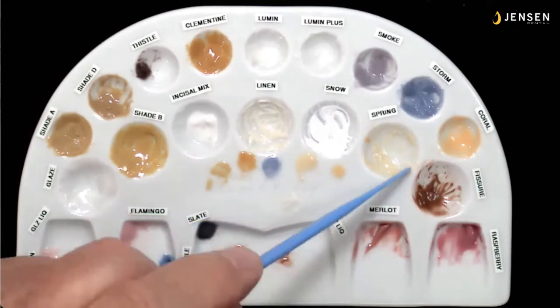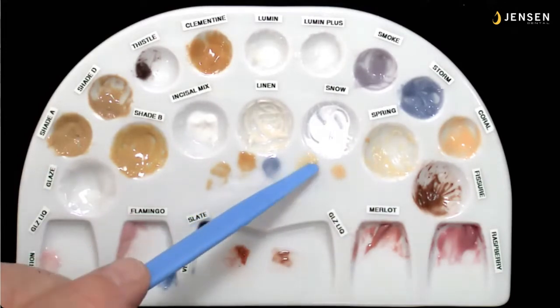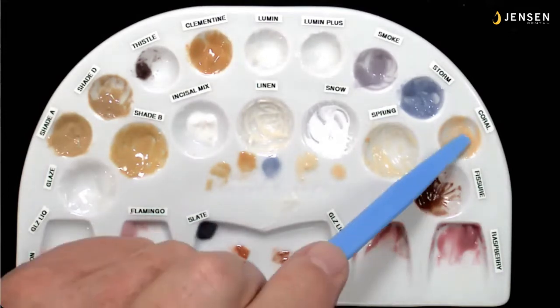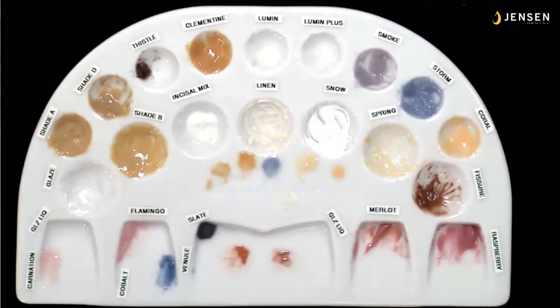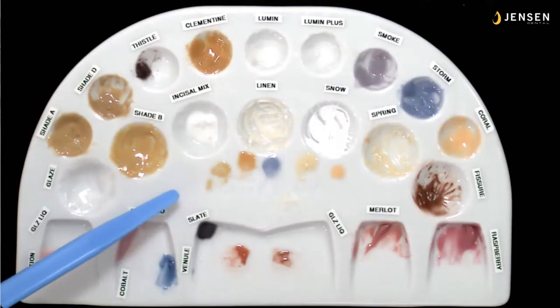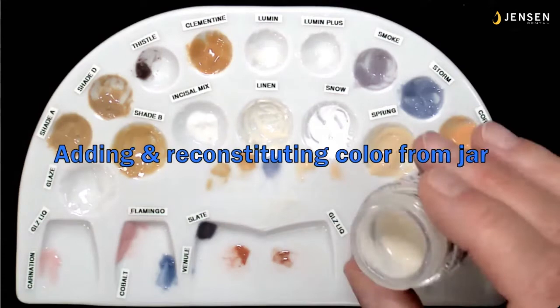And I just put a little in there, and I have put a little bit of the glaze liquid in it. For the colors I want to keep thicker and more intense, I'll leave them a little thicker. For the coral, the mamelon effect there, I'll make that a little thinner because I want that very, very faint. And the Clementine, the second one from the left, I have that a little thinner too because I want a translucent root look to it, or for the color emanating from the central fossa of a posterior. So I don't want it really, really thick in its intensity.